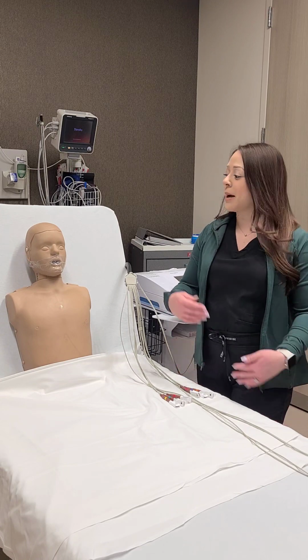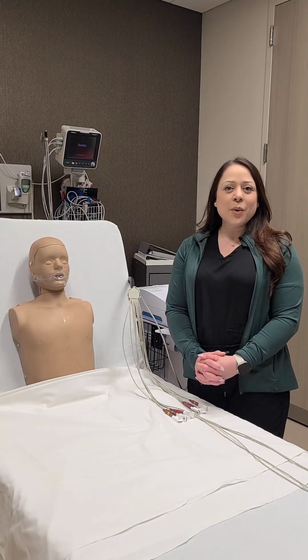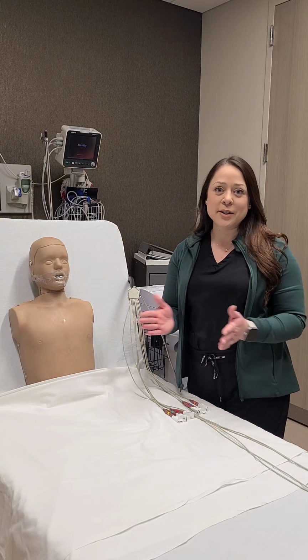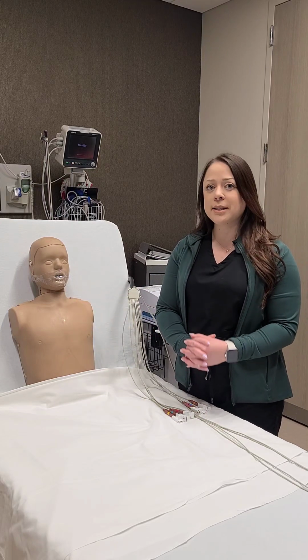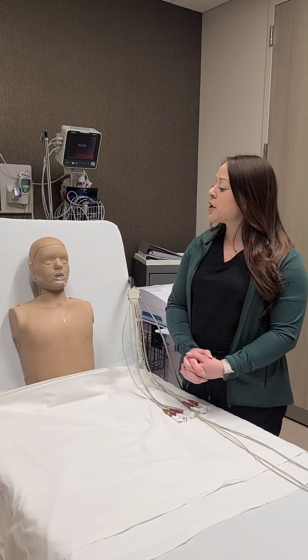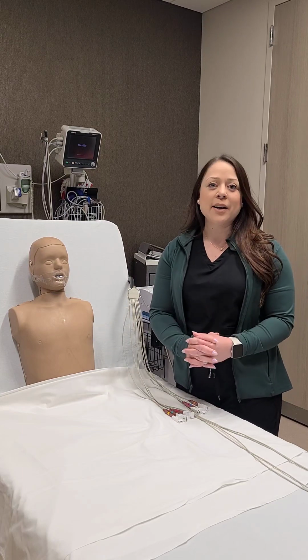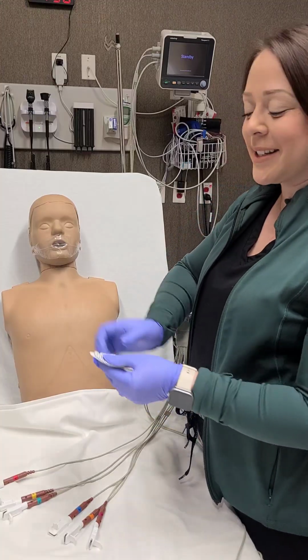Today we're going to be going back to basics on doing a 12-lead EKG. So why is EKG placement so important? Well, improper placement can lead to false diagnosis, misinterpretation, and potentially harmful clinical decisions for your patient. Ensuring proper placement is vital for best possible patient outcomes. So let's get started with the chest leads.